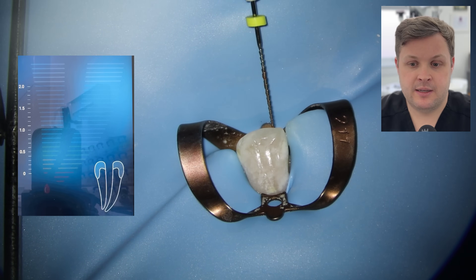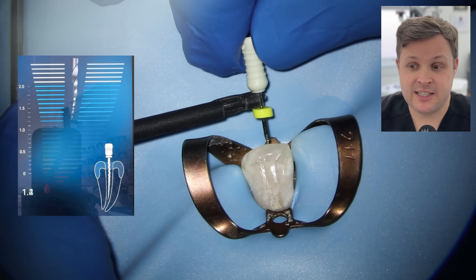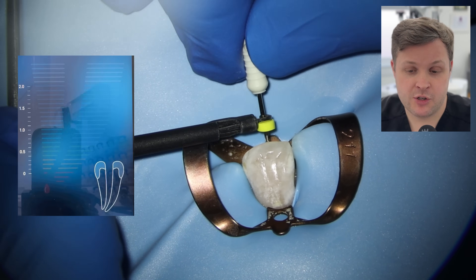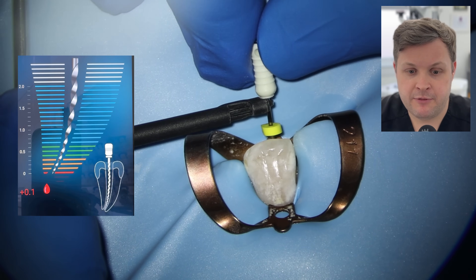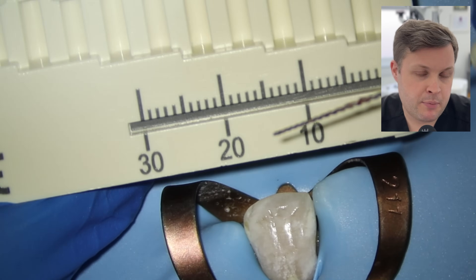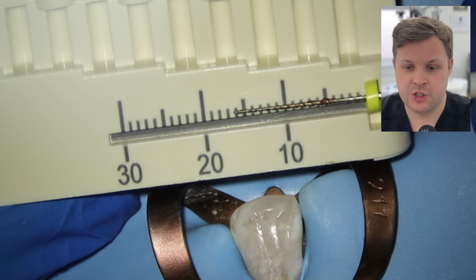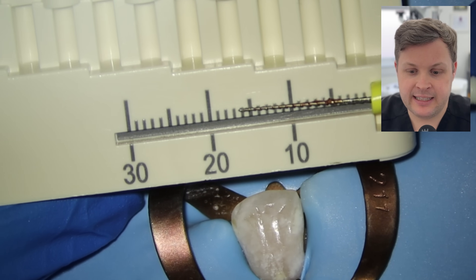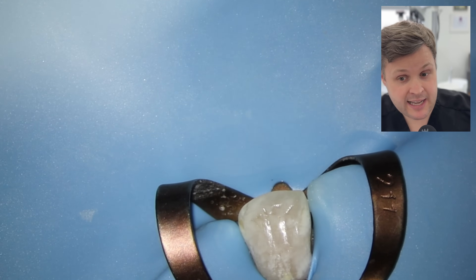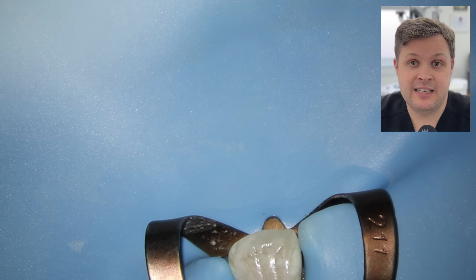So I'm going to use a high-diameter file — I'm concerned that if this is an open apex, there's a possibility that a smaller diameter file might give us a radius reading. But when we place the size 45 again to length, we're getting the same kind of reading. When we pull it out, we can see it's at 16.5 millimeters, which is way, way short. This is a bit of a red flag — I'm slightly concerned maybe this tooth is cracked, given the dental history, and there's an argument to say maybe I should be taking a cone beam CT scan at this point.